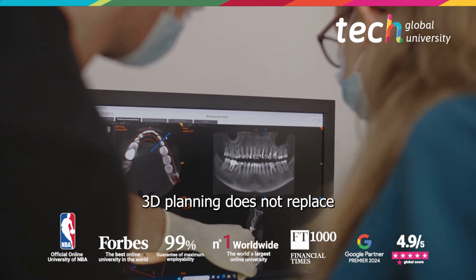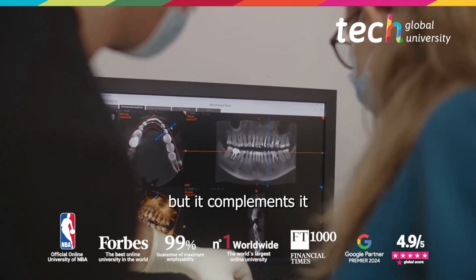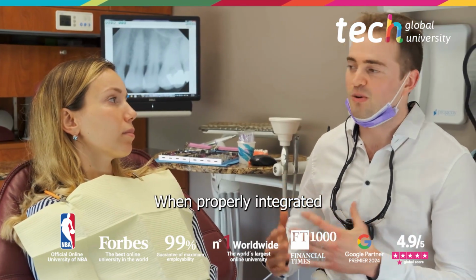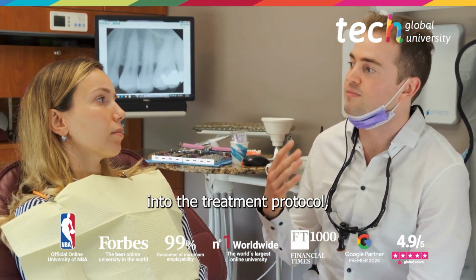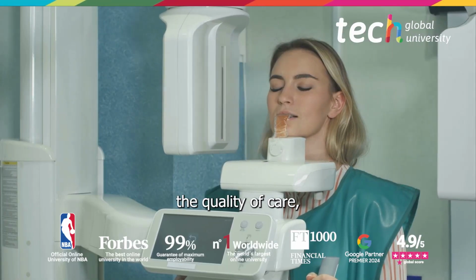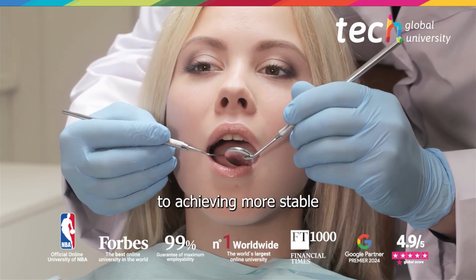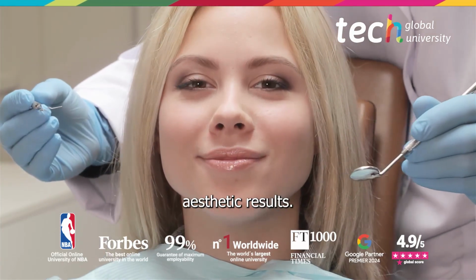3D planning does not replace clinical judgment, but it complements it with high-precision tools. When properly integrated into the treatment protocol, it improves the quality of care, minimizes complications, and contributes to achieving more stable functional and aesthetic results.